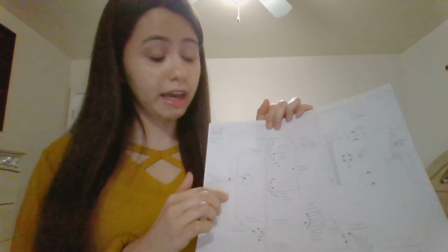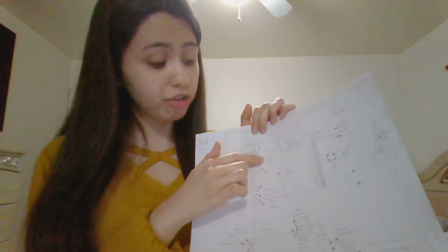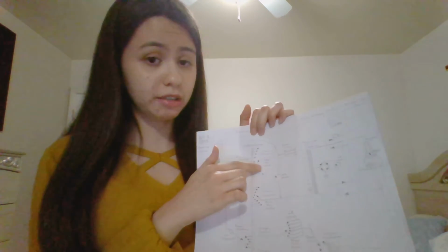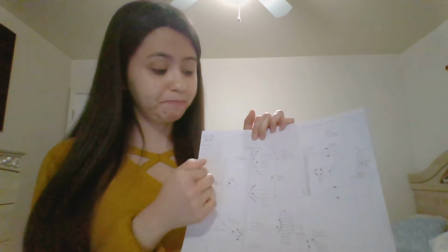So in our case, say we want to step it up to 85, it's going to go on through these little loops and it's going to go up. And say we choose 85, the major kVp selector is going to choose the tens place, the eight, and then the minor kVp selector chooses the five, or the ones place. And so the electricity goes in, there's an exposure timer here, and all that does is stop the exposure.